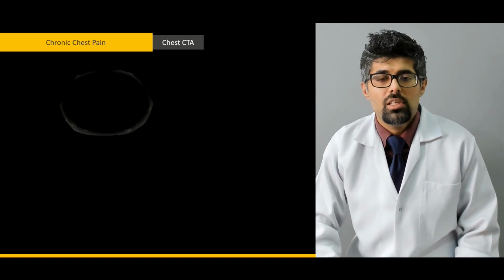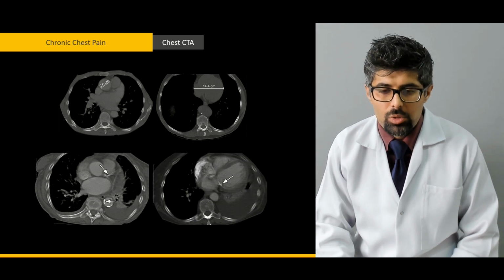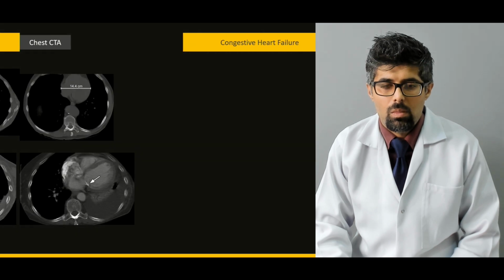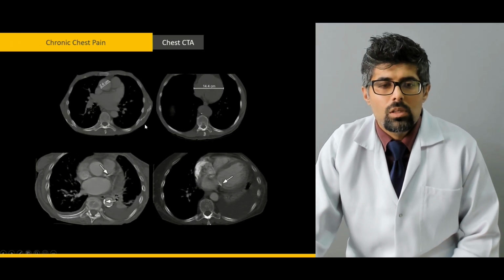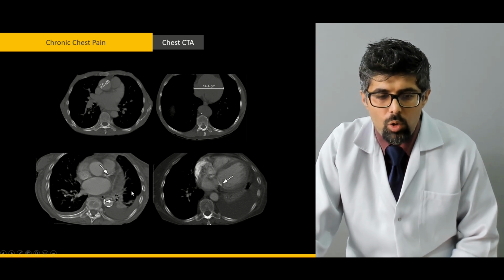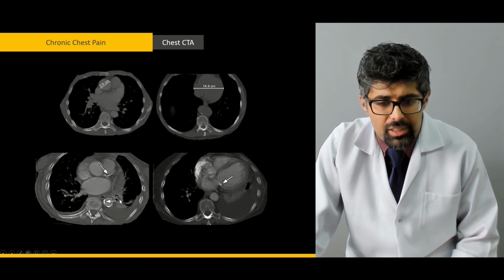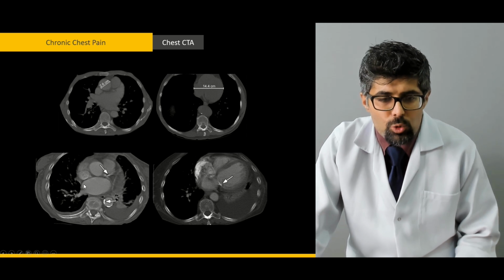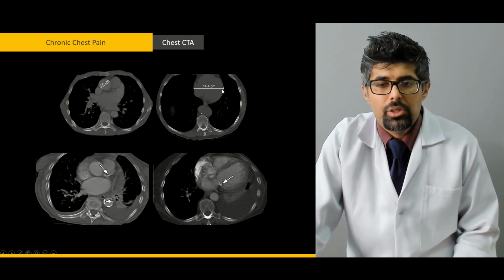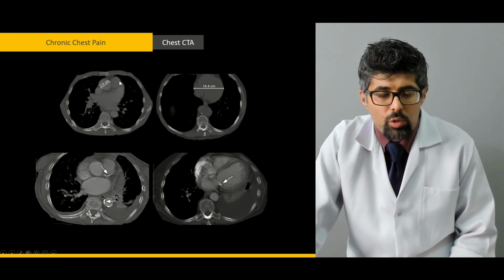Next, we have the chest CTA of multiple areas. Now I will describe. This here is the vasculature of the mediastinum, and all of it is expanded due to aortic aneurysm, aortic dissection, and chest CTA is confirming all of this.